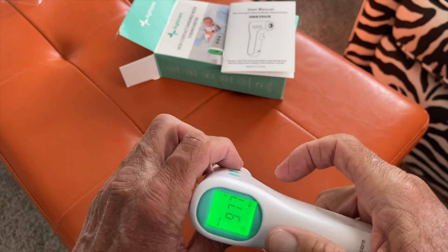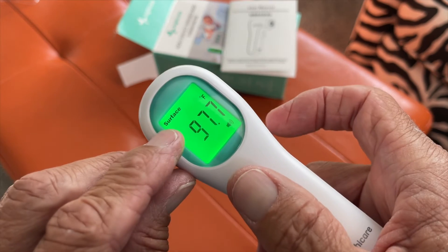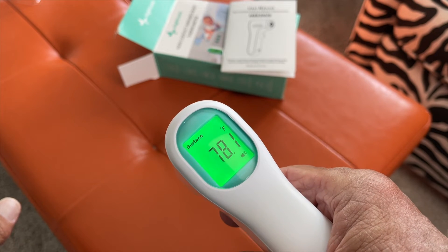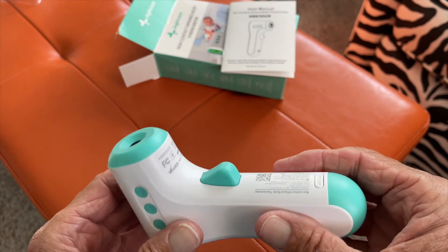Now if I want to change the mode — like if you want to check the surface of something, like your baby formula — you can do this. I'm just going to shoot it at the footrest, and that footrest is at 78 degrees. That's pretty much it, that's how it works.